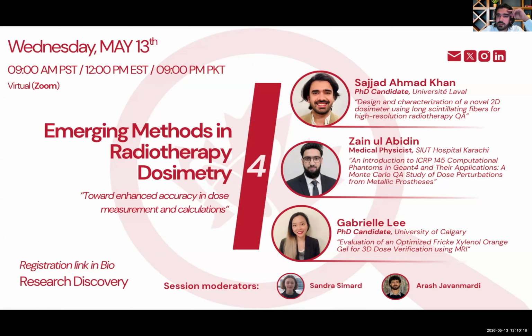I'm not sure I understand your question, but I think you're asking if the beam is diverging, will my... Yeah, right. The beam divergence will depend on the quality that you're measuring, right? Yes. And so if you physically implement it in your prototype, then your prototype will be specific to, say, a 6MV beam rather than being able to use it in an 18MV or other qualities and maybe at different setup distances.